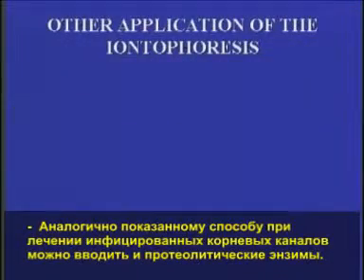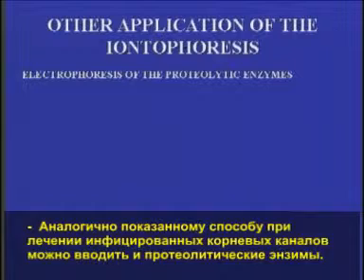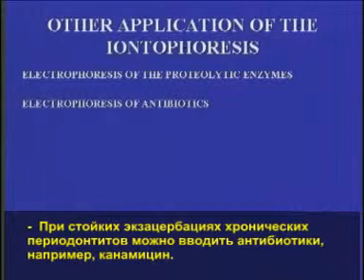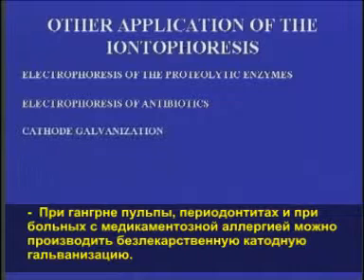In the same way, in infected root canals treatment, proteolytic enzymes can be inserted. In hard exacerbations of chronic periodontitis, antibiotics can be inserted, for example, kanamycin. In pulp gangrene, periodontitis, and patients with medicamental allergy, cathode galvanization without medicine can be performed.